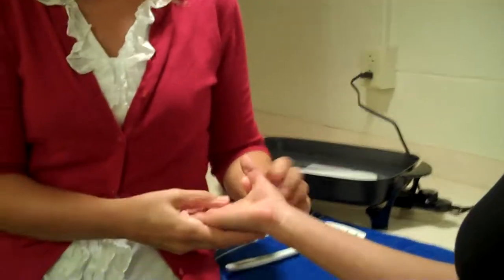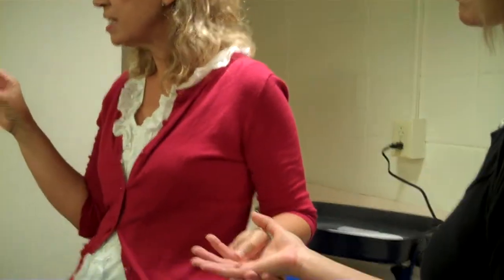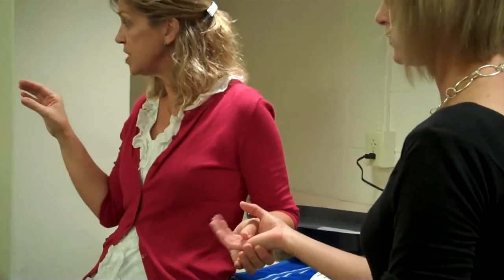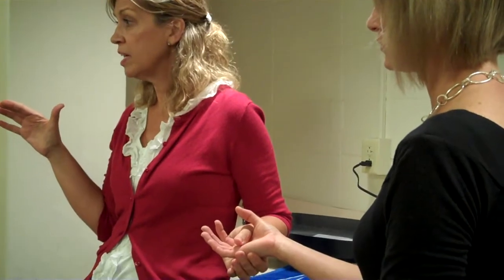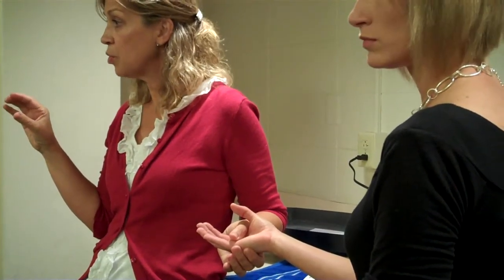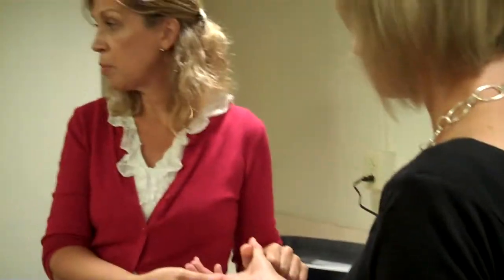gravity. And the other thing, when you're making a thumb spica, again, are they wearing it during the daytime? So do we want their hand or their thumb a little bit under in opposition? Or do we want their thumb way out here? For the purpose of this one, we want a little bit of opposition, because when they hold their papers or whatever, we want them to be able to do that. So don't have that thumb propped way over here.